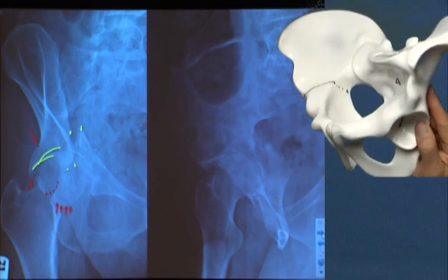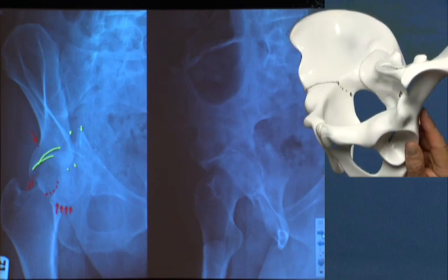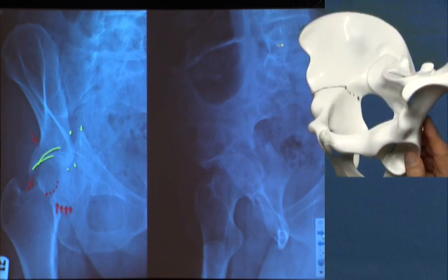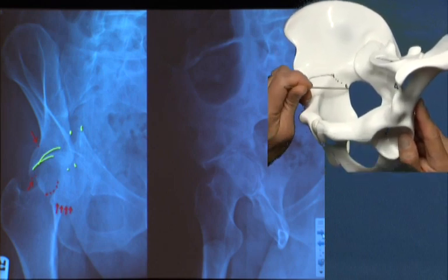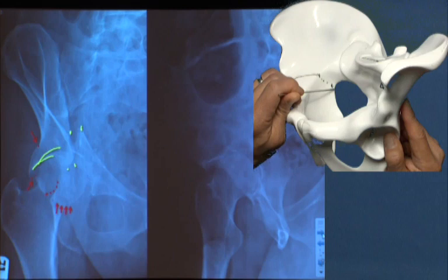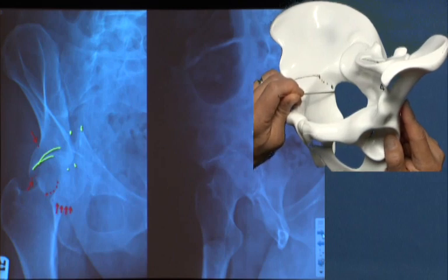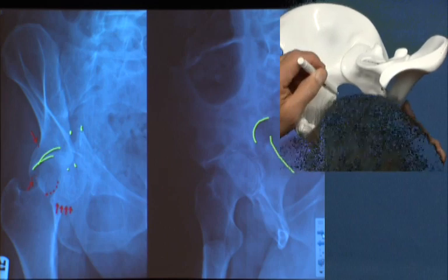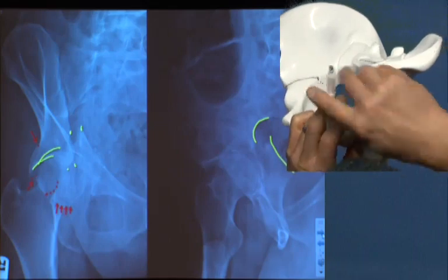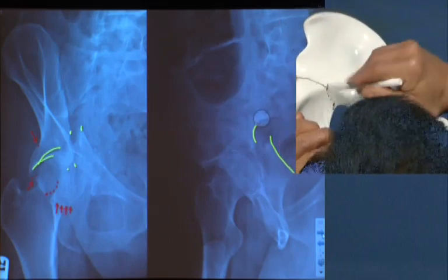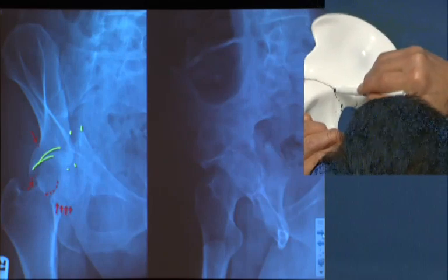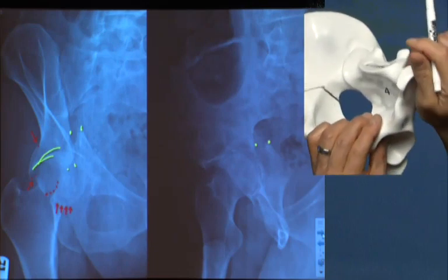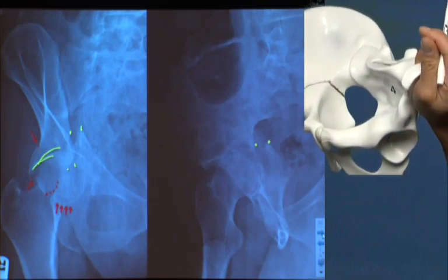Now I'm going to rotate this to represent an iliac oblique view, and again we're going to confirm the information we got from the AP pelvis — that we have a fracture line crossing just below the curvature of the greater sciatic notch. As I follow the greater sciatic notch, I would say this fracture line exits a little bit lower than I had appreciated on the AP pelvis, but not much. This fracture line is going in that direction to exit the greater sciatic notch, and we can see that displacement there as well.